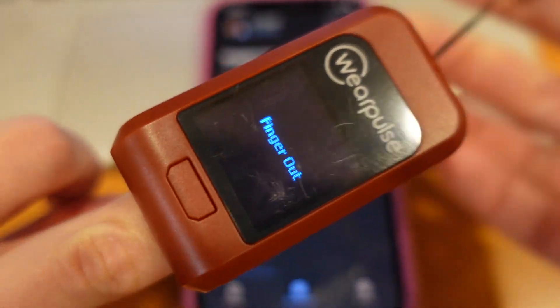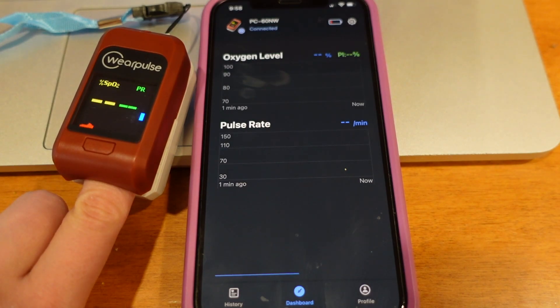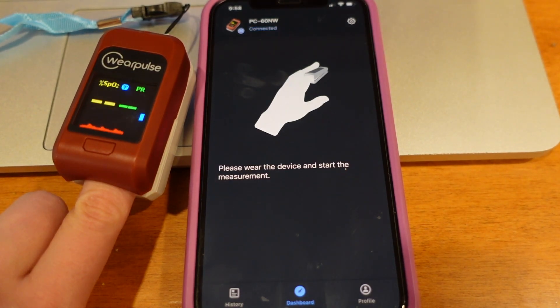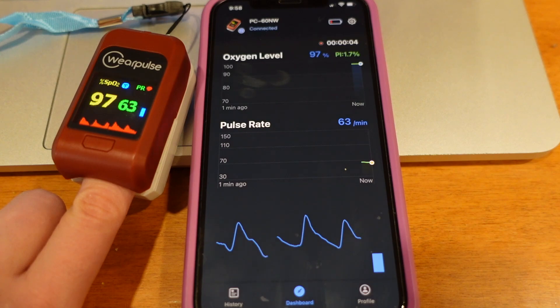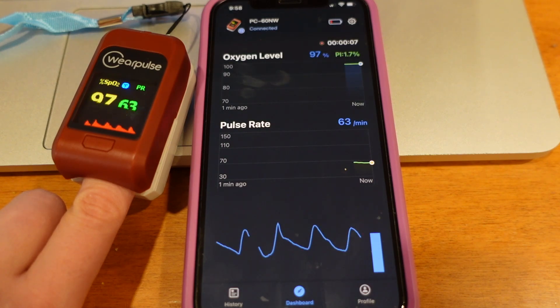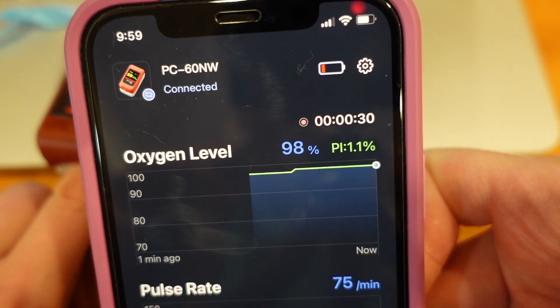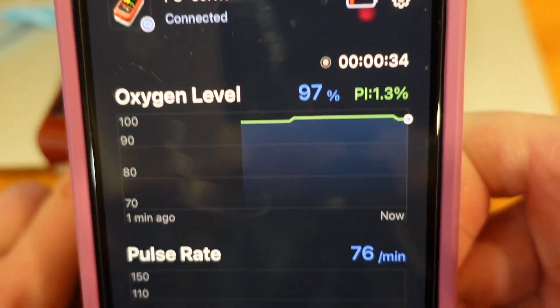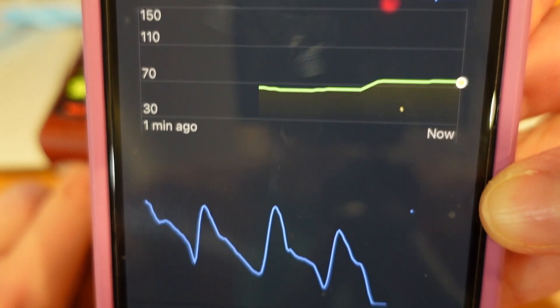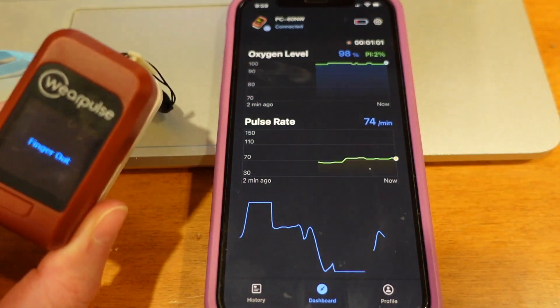This is what the app will show you if you choose to pair your phone to it. The device connects to your phone by Bluetooth, and if you want your sessions to be stored in the app you have to open the app when you put the oximeter on your finger. On the dashboard you will see your oxygen level and pulse rate, but also your perfusion index and the amount of time you've been recording. It also has a graph line on the bottom, and when you remove the device from your finger it automatically displays the details of your session.